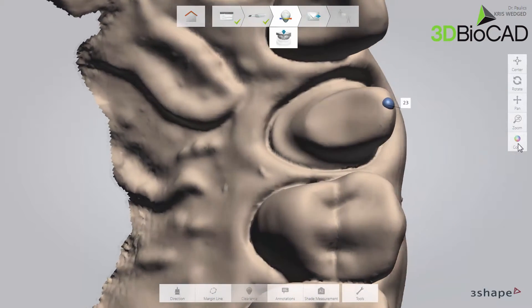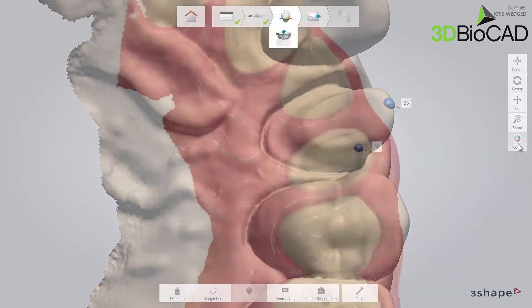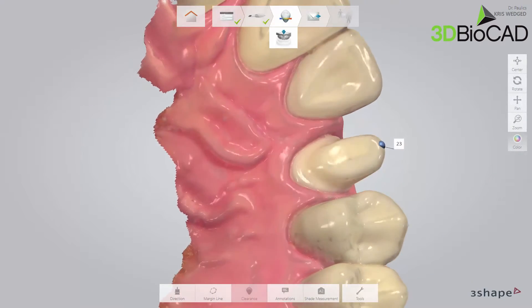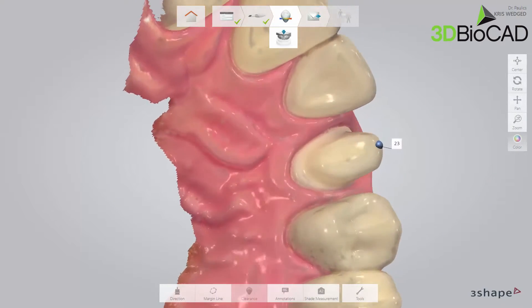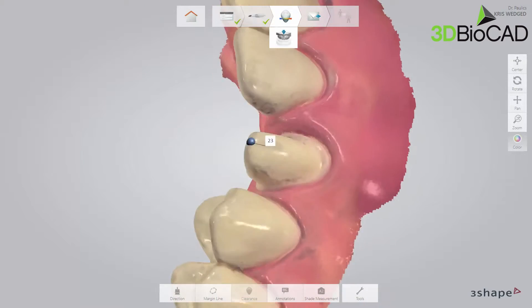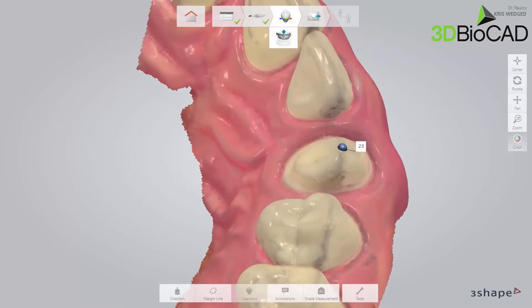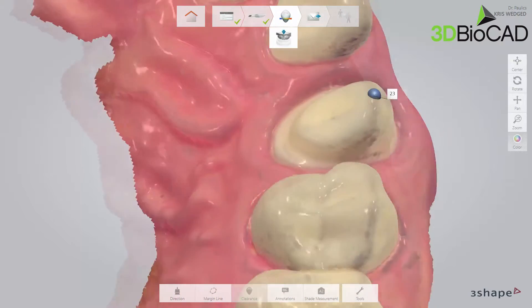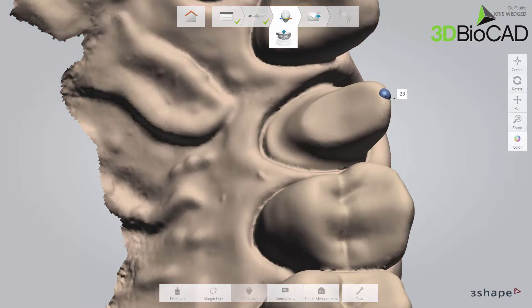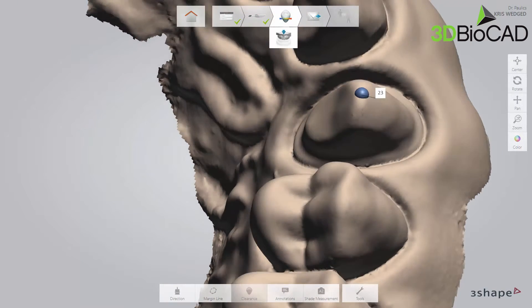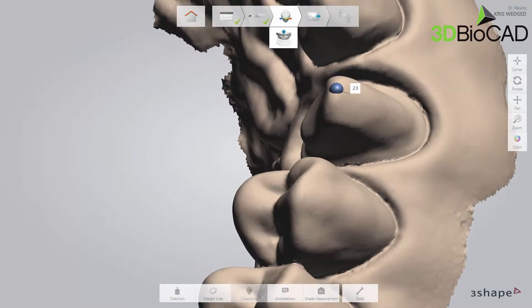The scan shown on the screen is the preview from the scan page. By invoking the post-processing, you will bring out even more detail. In general, 3Shape recommends to post-process before setting the margin line, as the margin will stand out more clearly and consequently will be easier to set.